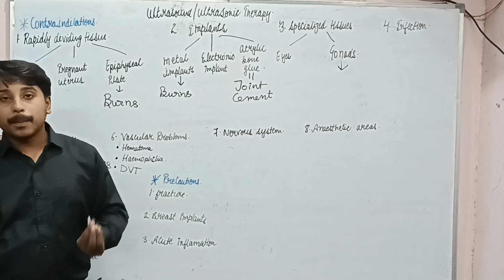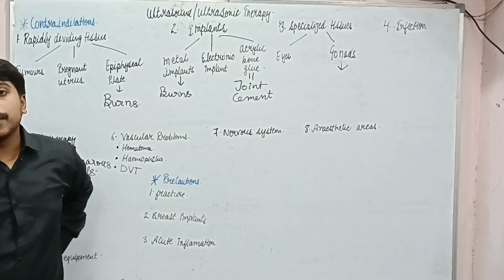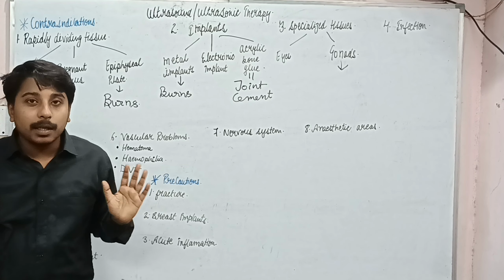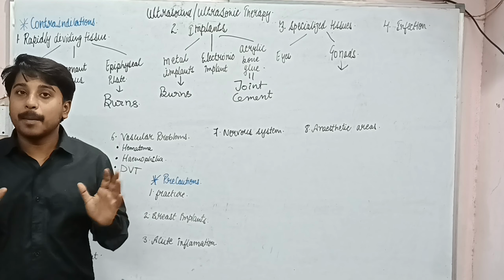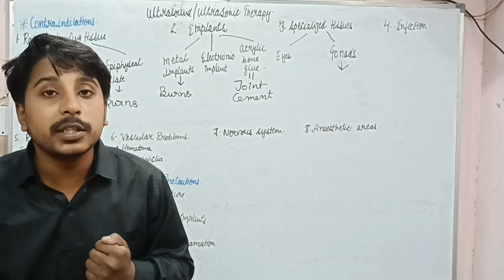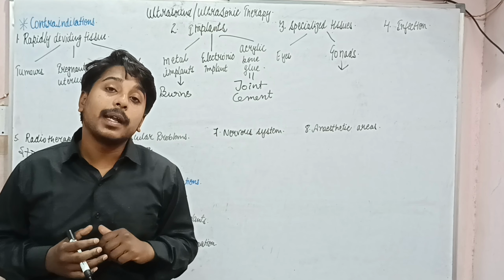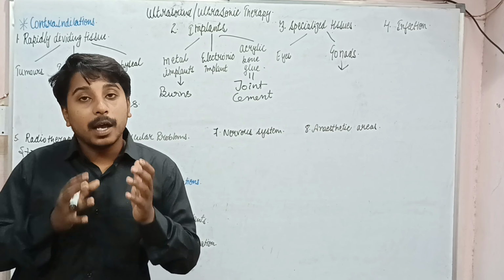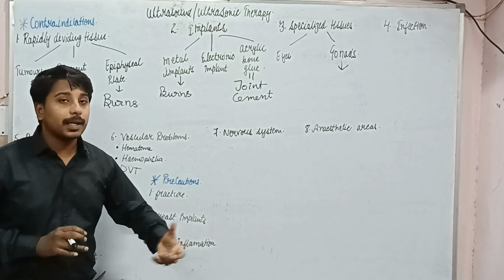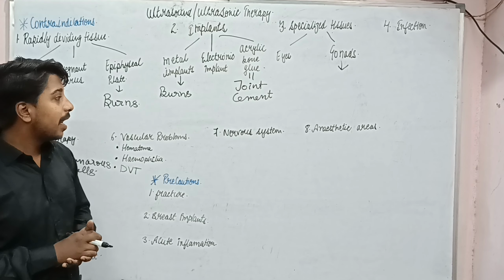Nervous system, okay. Application of the ultrasound on the intact skin on our back, that is good. Okay, so there has been reported no harmful effects of its application. But in case the spinal cord is superficial, for example in case of laminectomy, and in the case of spina bifida where the spinal tissue is superficial, some problem can occur, so we will avoid its use on spina bifida and laminectomy.